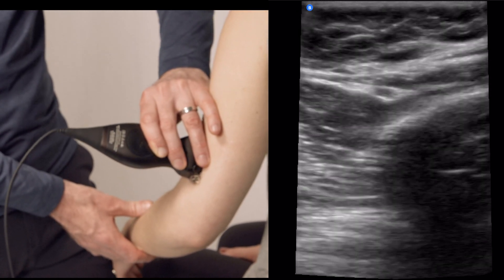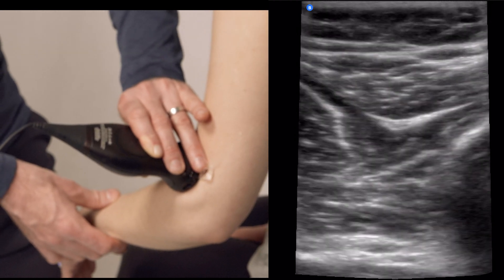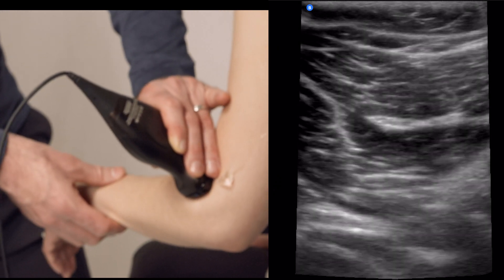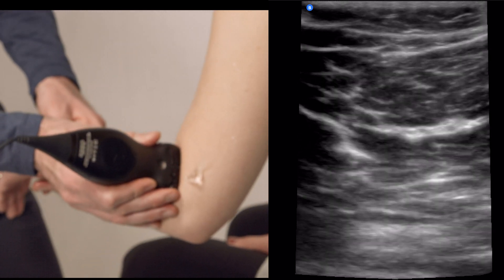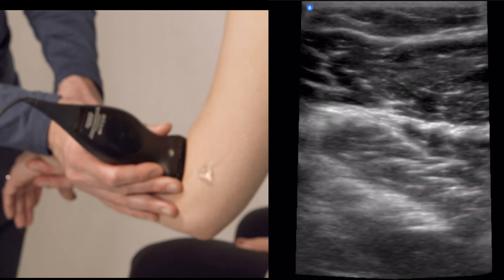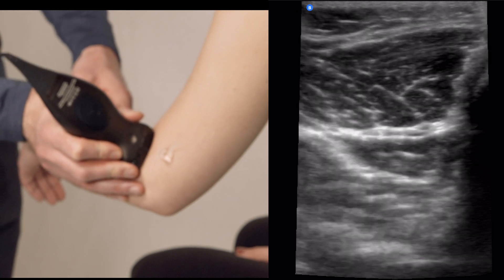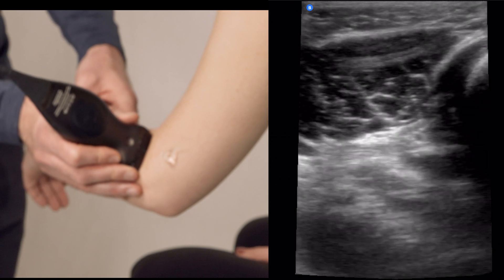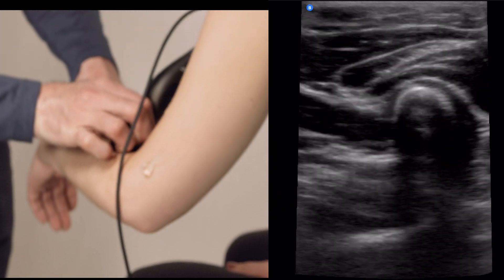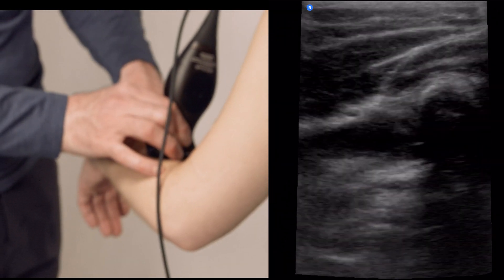Now for the distal portion of the humerus — we're going to follow the radial nerve as it starts to dive down deep to the brachioradialis. It does a few things: the first thing it does here is begin to split. In this area we'll straighten the arm a little bit, and you can see there are several fascicles. The superficial radial nerve is going to rise superficially.